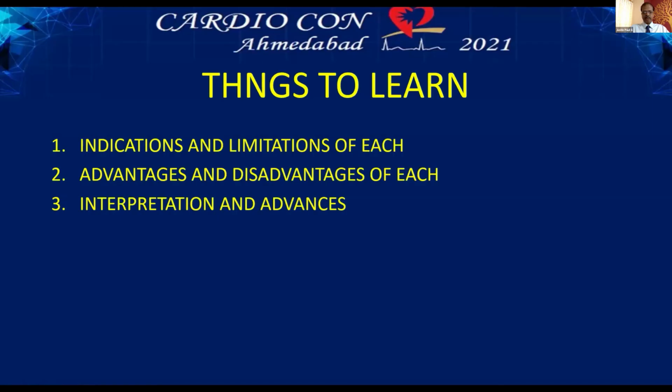And he also talked about that with a high definition IVUS, we can have a resolution of up to 22 microns, which almost matches what you're going to get in OCT. So Dr. Mahesh did not stay behind. He came back with full vigor, saying that all of us will have to be prepared to manage cases with in-stent restenosis. Almost 11% of them are going to come back in 5 years' time.